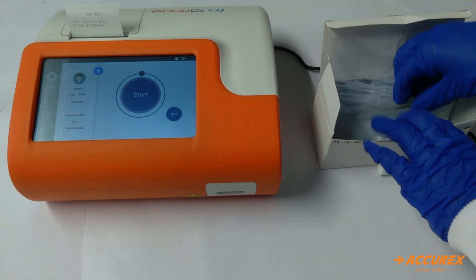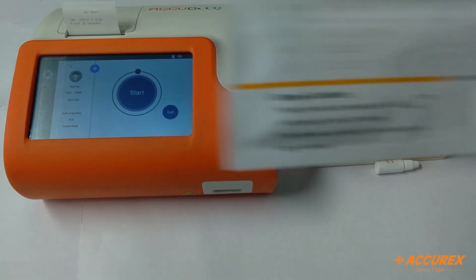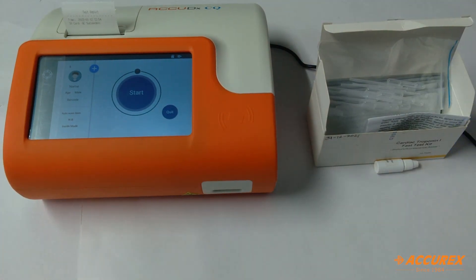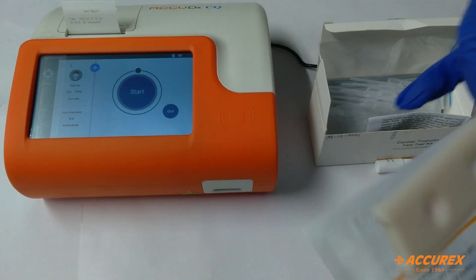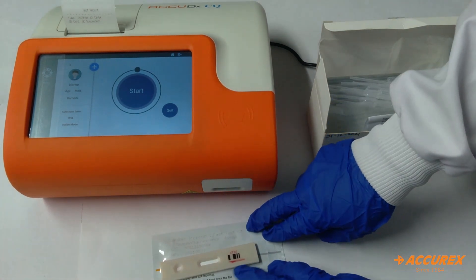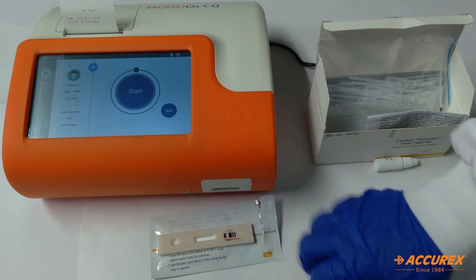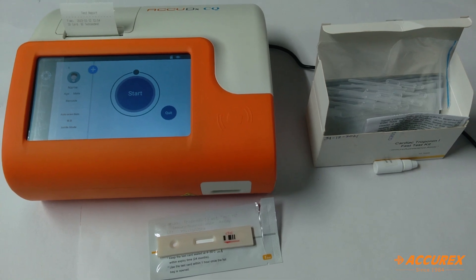Now we'll start with the testing. We'll take this test kit and open it. This is the test strip, so we'll keep it in a clean horizontal place like this, and then we'll add the sample. We'll add the sample in this slot — according to the pack insert we have to add 100 µL of blood sample.